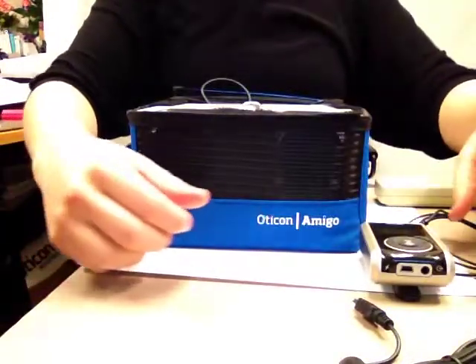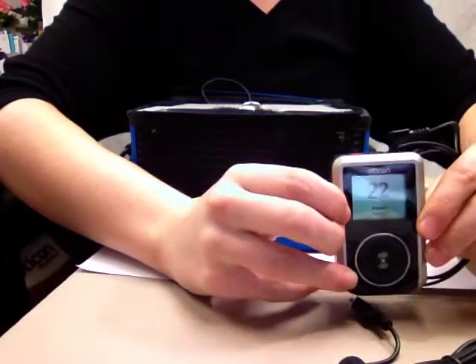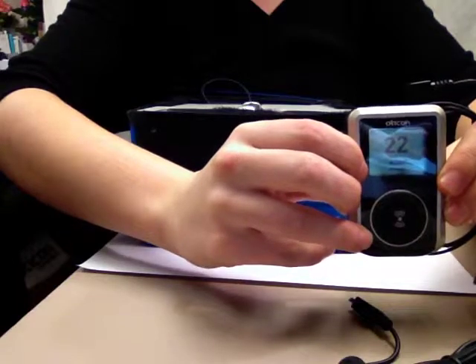Turn on the Oticon T20 transmitter by pushing the button on the transmitter's top and holding it down until the LCD screen on the front activates. You should see the transmitter's frequency on the screen.